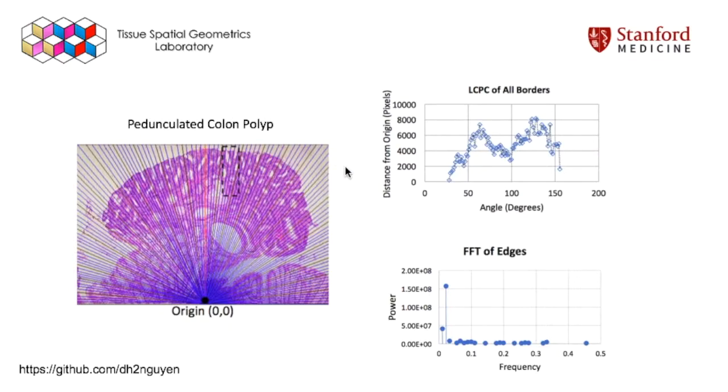And I want to point out that this LCPC algorithm can be applied to any type of image, really, not just histology, but CT and MR data. But that will be in a future presentation.